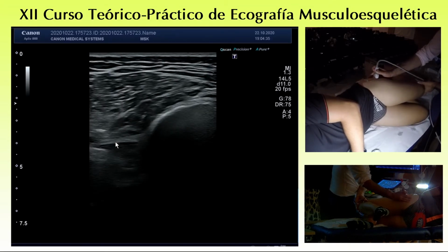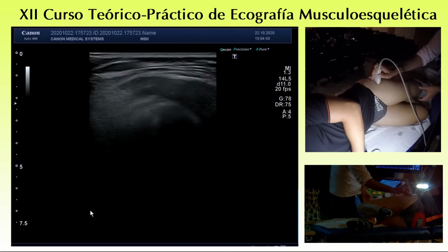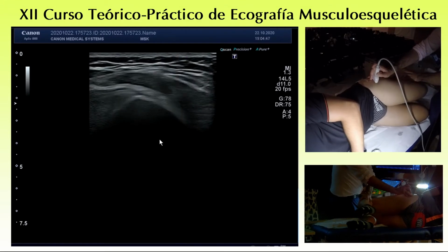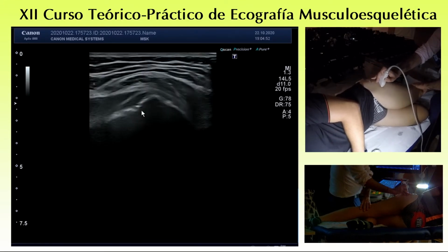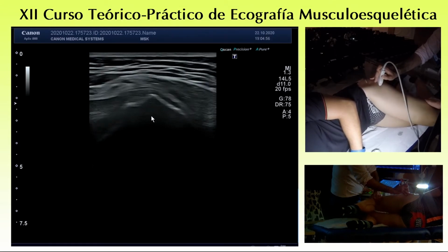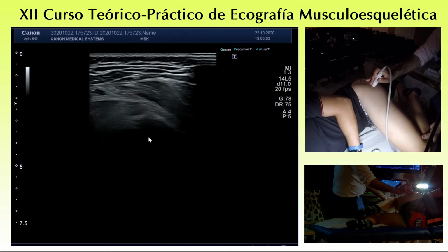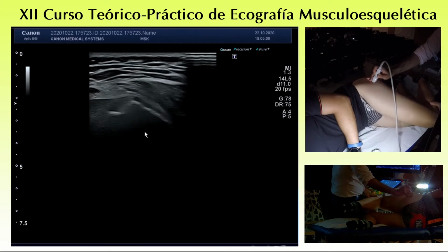Glute major here, sorry. So okay, glute major. This is the fascia lata, you see it very well here. So from extension here, you go in flexion, and you see that the fascia lata tended to move backward, but not much. In pathological case, in maximal flexion, you see the snapping.